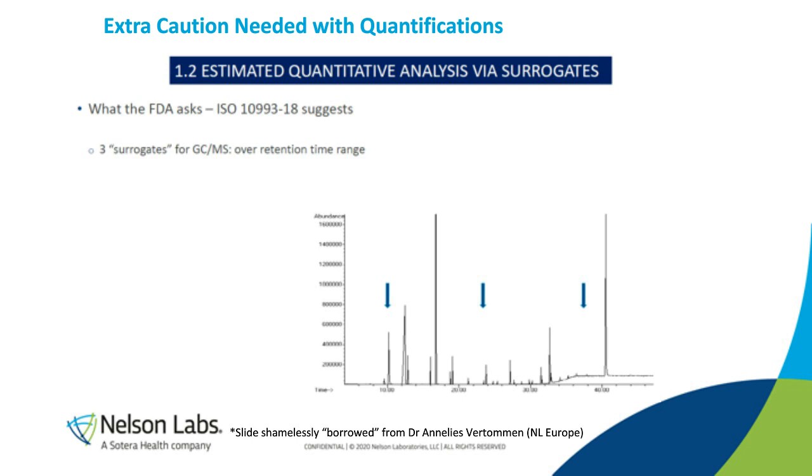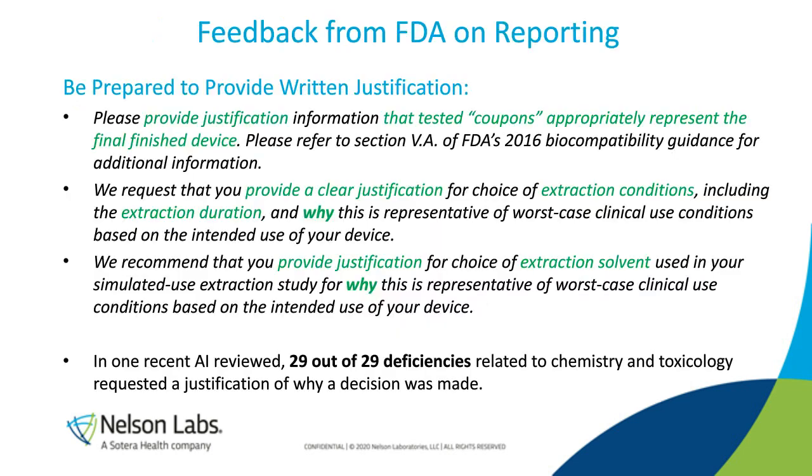So, okay, that's kind of the identification process, and that's why the FDA is asking some of these questions. They want to make sure that the quantification process is better than just using an internal standard, because they've seen examples where just using a single internal standard can go bad.